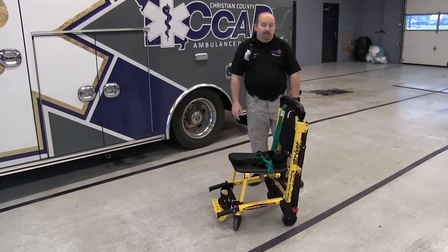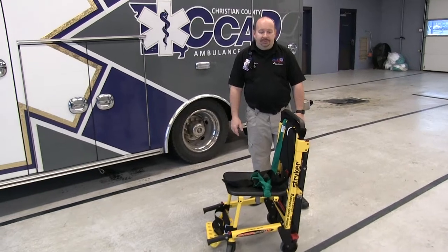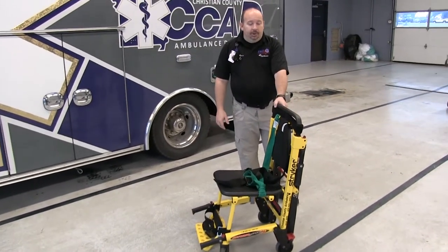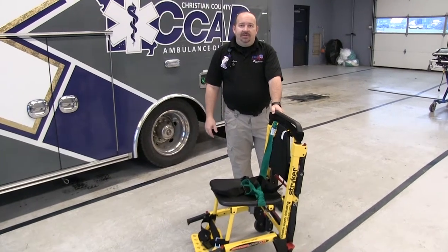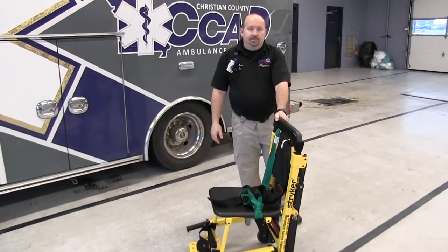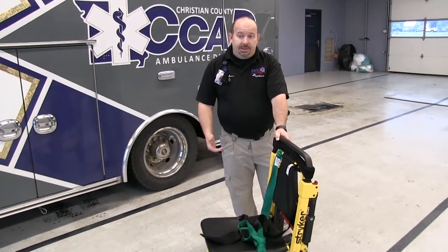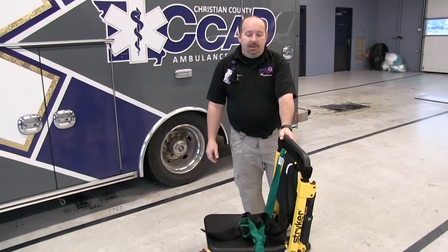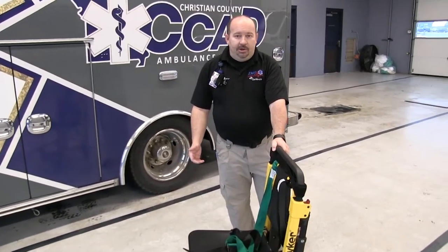Good morning. My name is Mike Gooch. I'm a paramedic and educator for Cox Health Systems Pre-Hospital Division. We're going to discuss the Stryker Stair Chair, some of the features and benefits that we use system-wide in pre-hospital. It allows our crews to safely handle and move patients, reducing our injuries and improving function throughout.